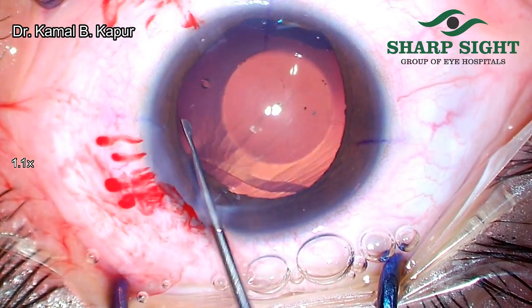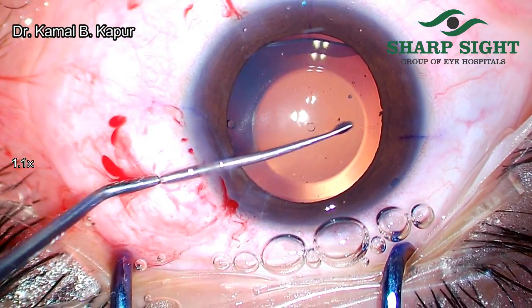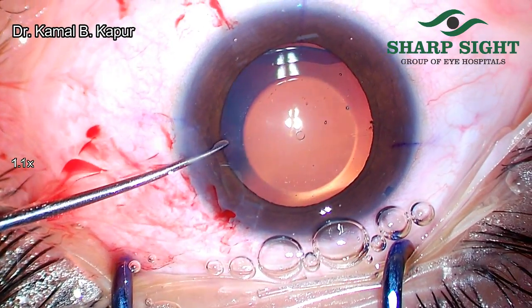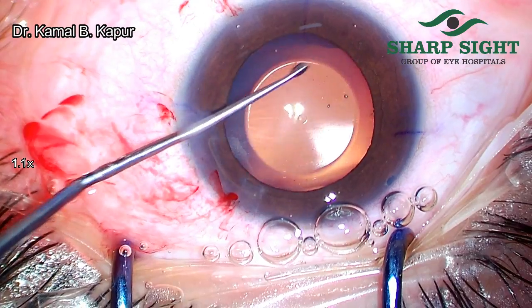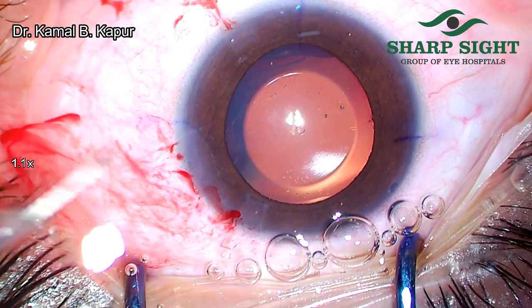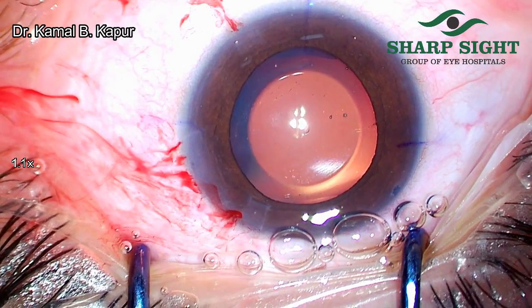Once this is done, what we need to do is align the two holes of the ICL to our 0-180 marking. In this particular case, the lens was supposed to be inserted at 0-180, so that is the place where the ICL goes inside the eye.